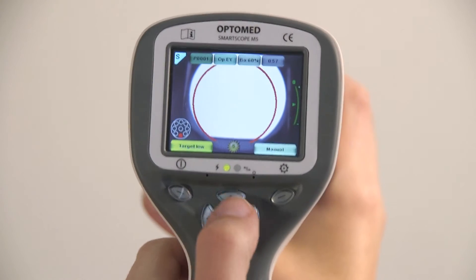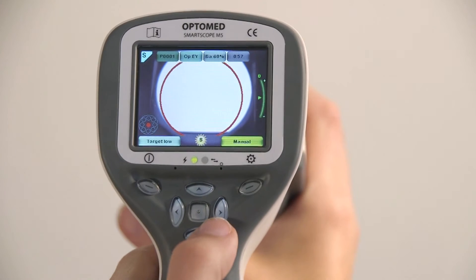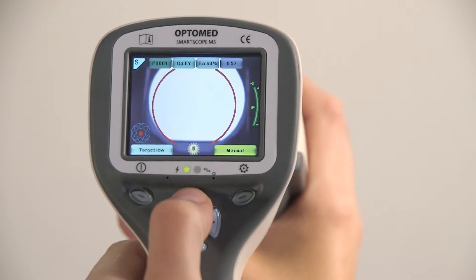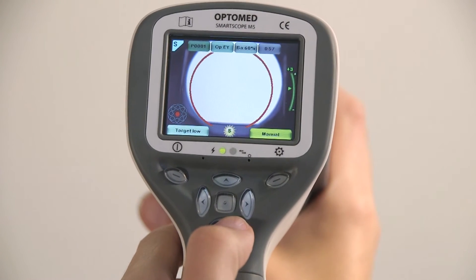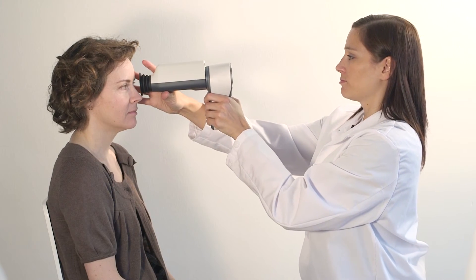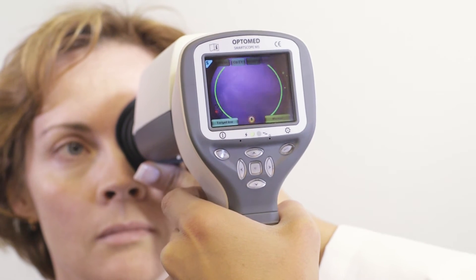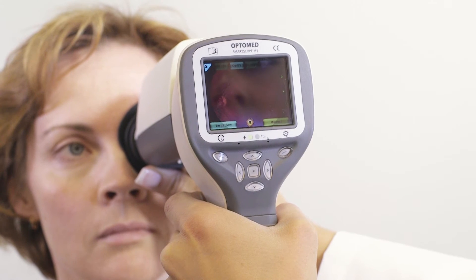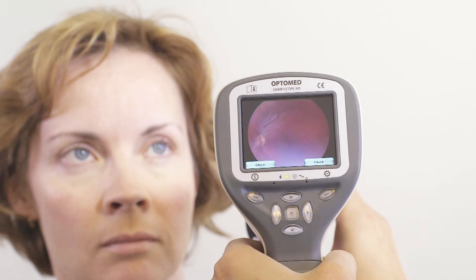With manual focus selected, you will need to adjust the diopter scale for the refractive error of the patient. By pressing the up and down arrow keys, you can change the focus point of the camera. After selecting the correct diopter, the image can be captured without additional focus adjustment. Simply approach the eye until the aim help circle turns green, then capture the image by pressing the shutter button to the second position. This is the easiest usage mode for inexperienced users and is also highly recommended for non-cooperative patients.